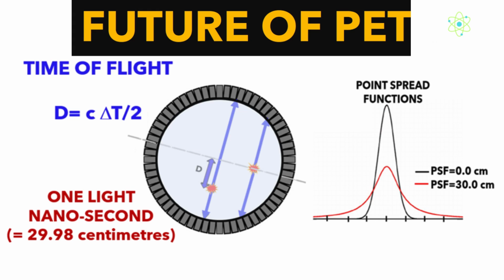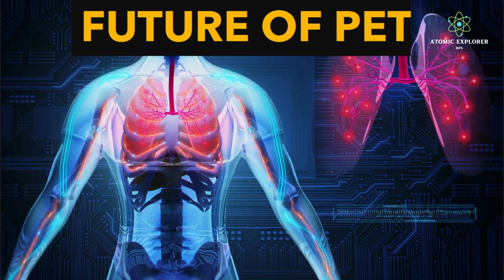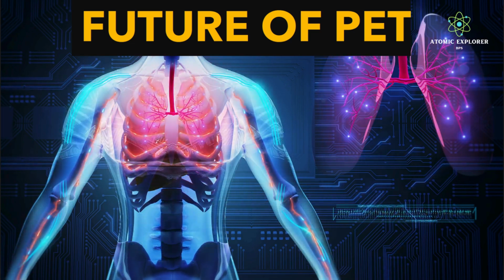Time-of-flight PET scanners also offer the advantage of faster imaging times, reducing the duration the patients need to stay inside the scanner machine. The image here illustrates how time-of-flight positron emission tomography scanners work. First, let us understand the key concept.